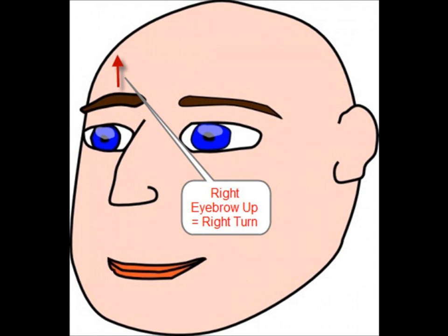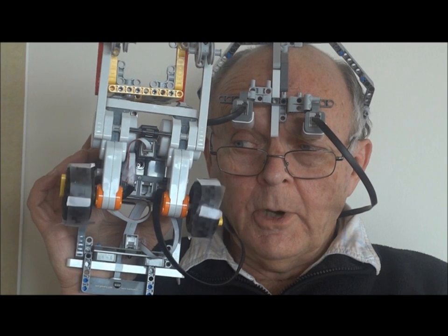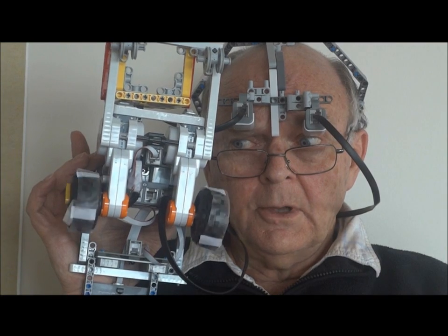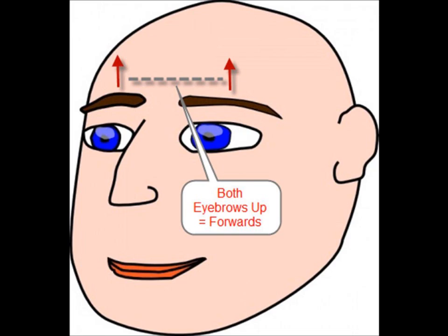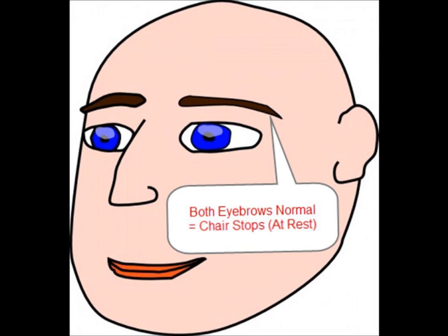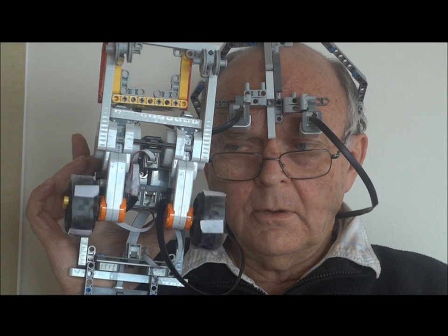Right eyebrow up, we do a right turn. Left eyebrow up, we do a left turn. With both eyebrows up, we can go straight ahead. And with both eyebrows in their normal positions, we stop.